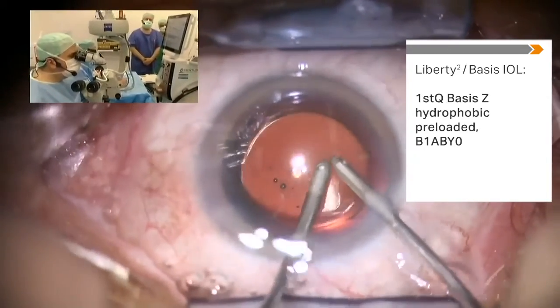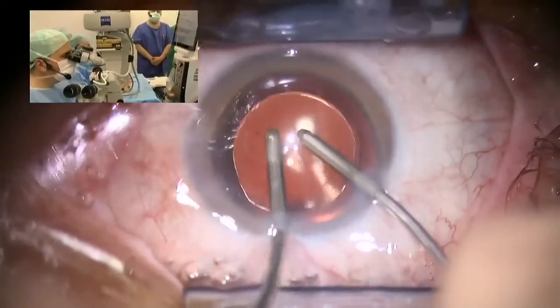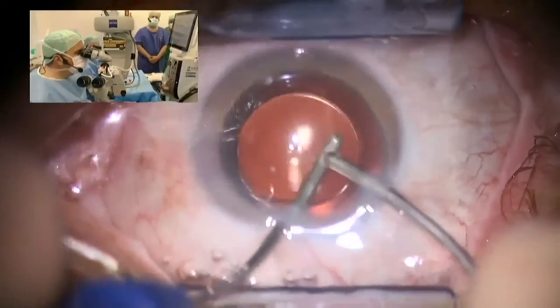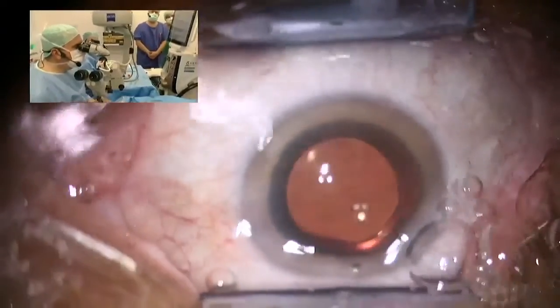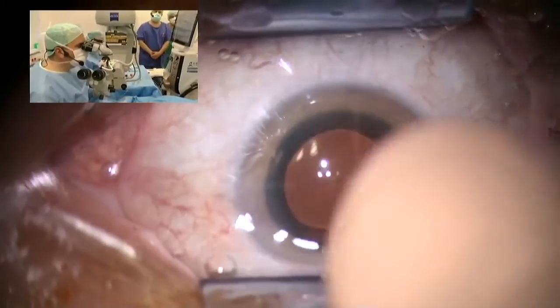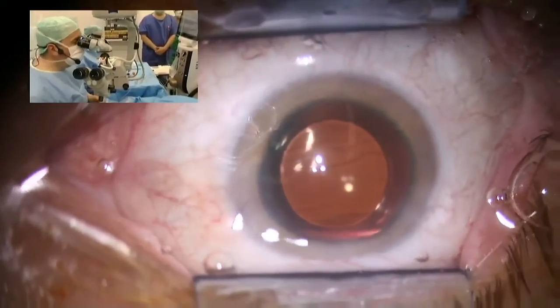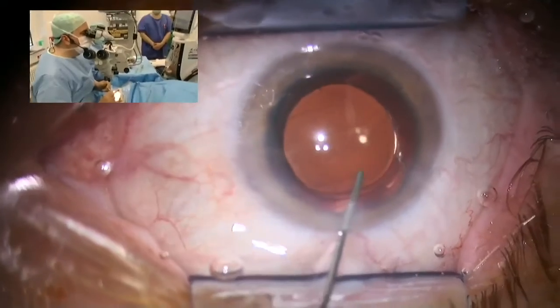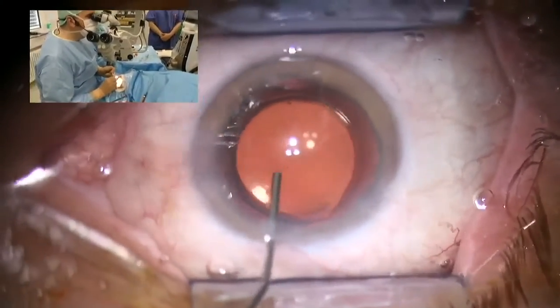We established two kinds of techniques. The one is in the softer cases, as you could see today, the bowling technique, where you circularly move inside the capsular bag to remove the nucleus and then the cortex.